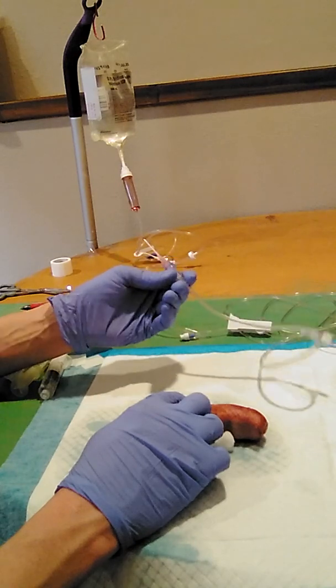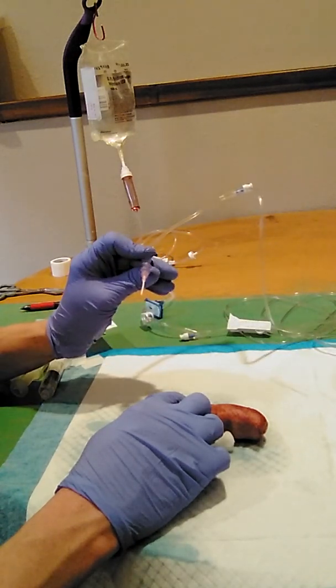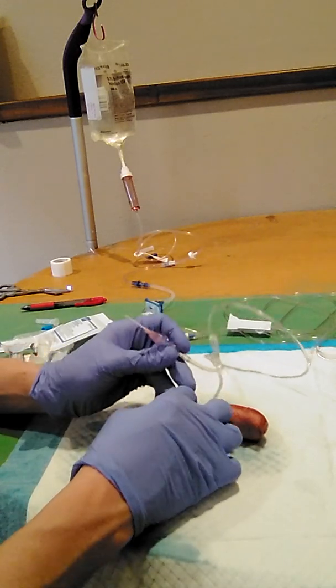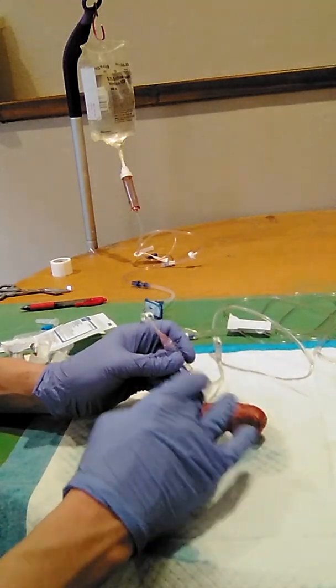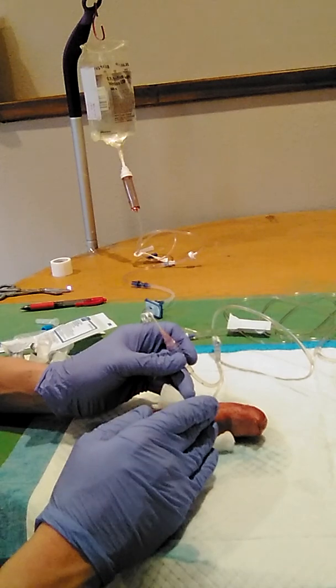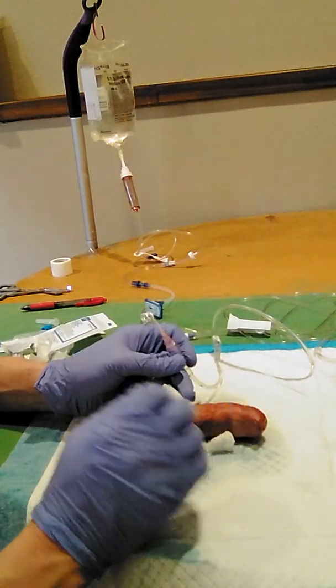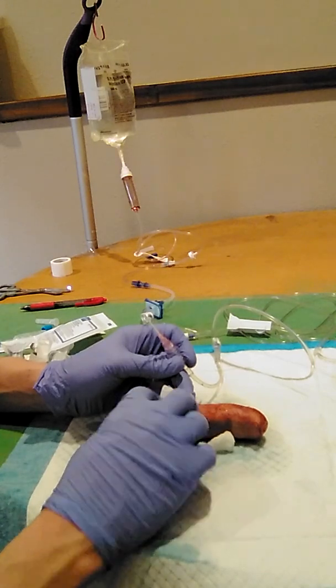And I'm making sure that the entire and intact catheter has been removed from the patient's vein. And I'm examining for any infiltration, any redness, swelling, any tenderness reported from the patient or inferred from me.